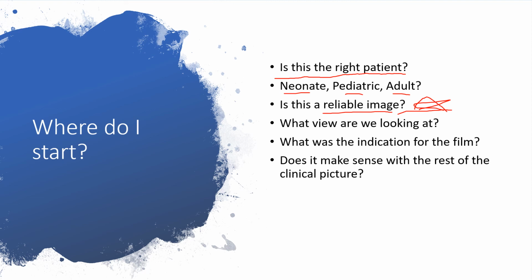As far as views for diagnostic X-rays, these are the ones where the patient goes down to the radiology department, stands in front of a big giant cassette, and the X-ray is taken from behind. It's called posterior to anterior because it shoots from their spine through their chest and hits the cassette in front of their chest.